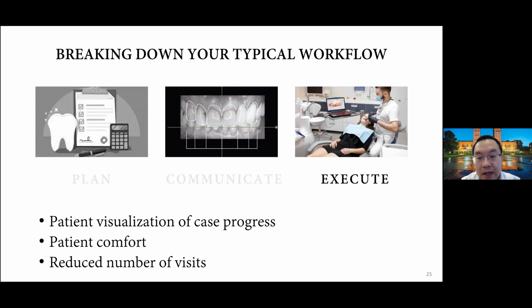And in terms of execution, the patient is able to visualize the case progress much better. Let's say you're doing a CAD/CAM case, right? You start off with a pre-op scan. They are already wowed, because you're able to show their teeth. They're seeing their scans for the first time, and then you prep the teeth. They get to see how the prepped tooth is going to look. Sometimes when you show the patient how the teeth or the prep is going to look, you have to show the patient a mirror.